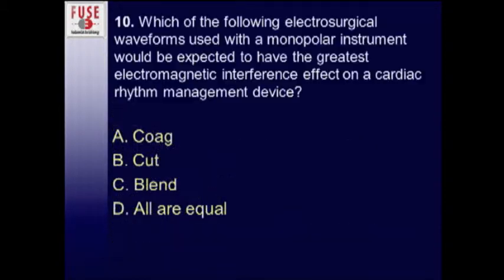And last question, number 10. Which of the following electrosurgical waveforms used with a monopolar instrument would be expected to have the greatest interference effect on a cardiac rhythm management device? Is it coag? Is it cut? Is it blend? Or is it all are equal?